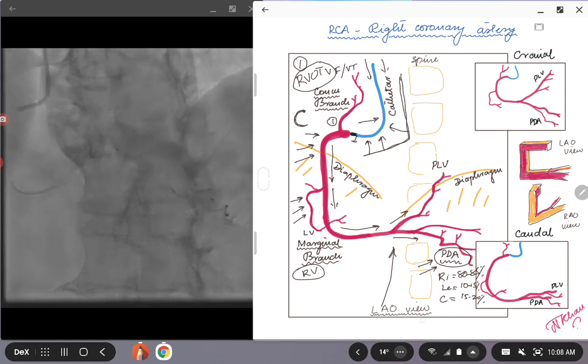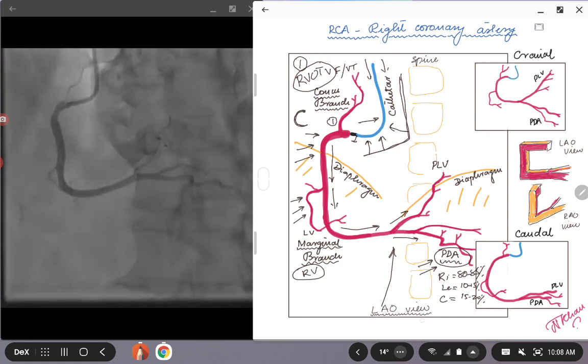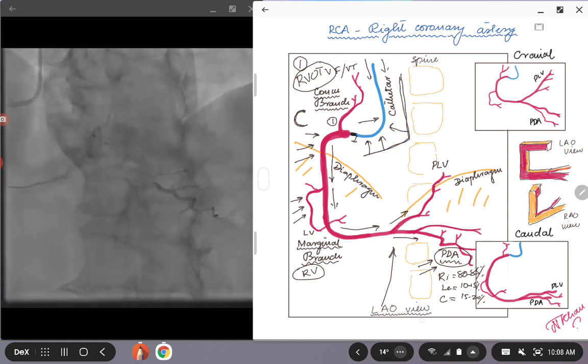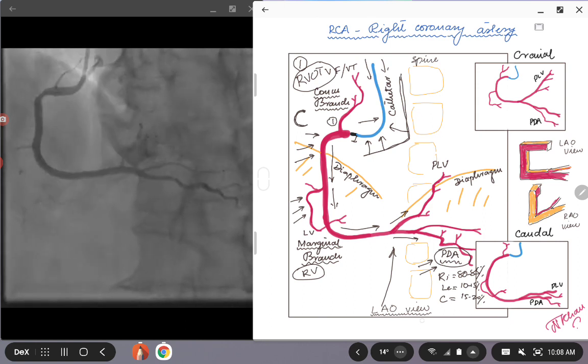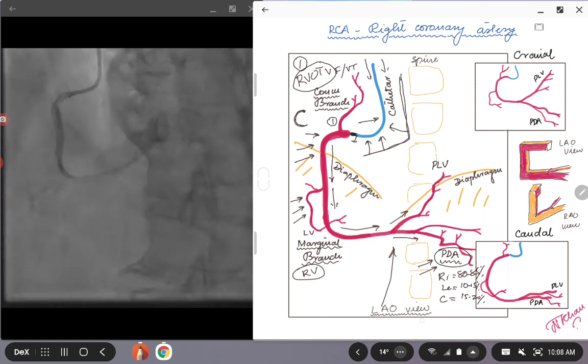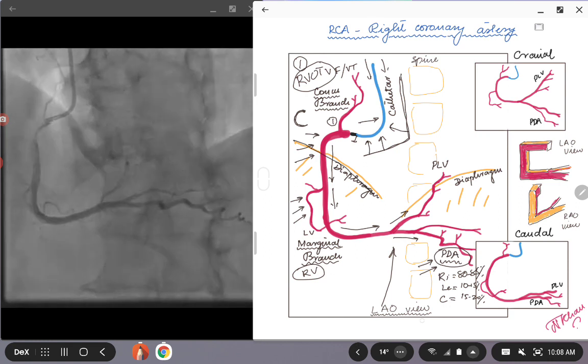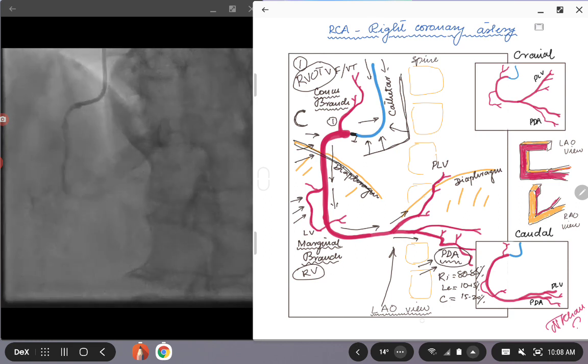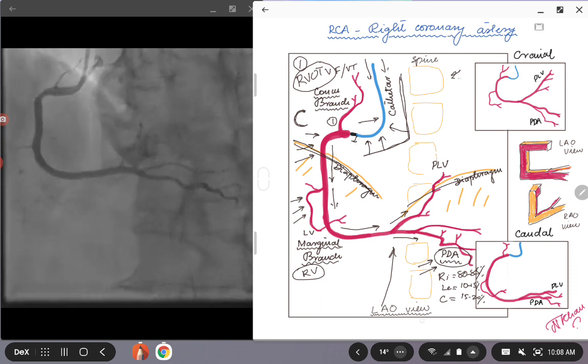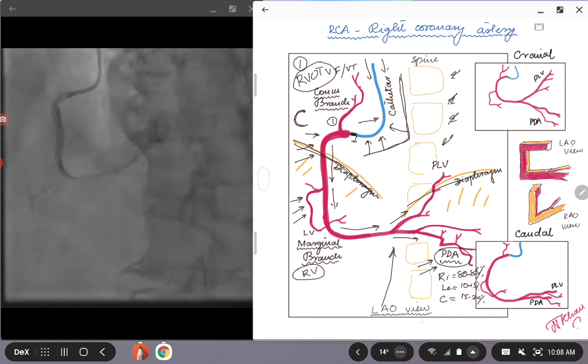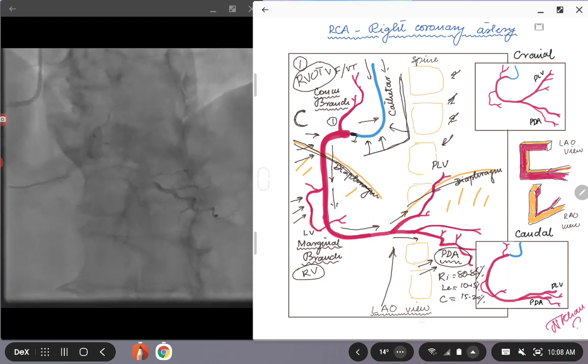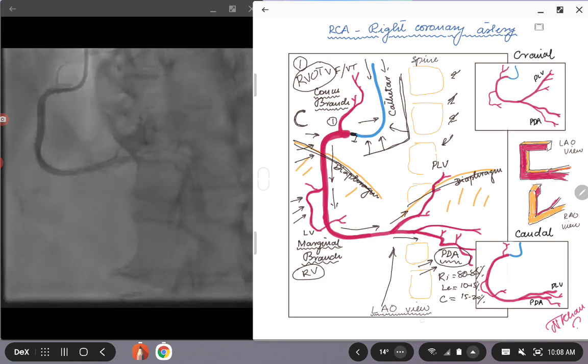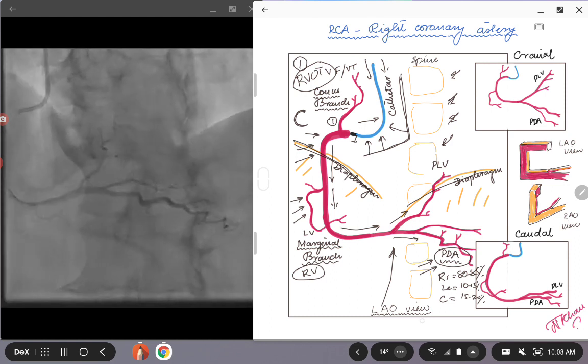With that, we move on to the structures other than the coronaries. In the angiogram you see the diaphragm here coming into the view and the spine. Depending on how much angulation you have on the II, the spine might be shifted towards a little bit on the right or maybe in the center.